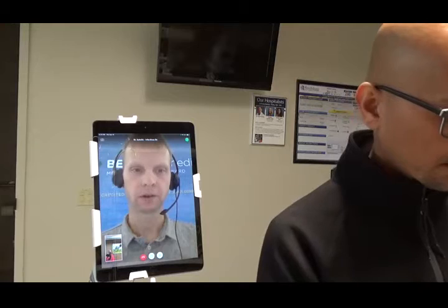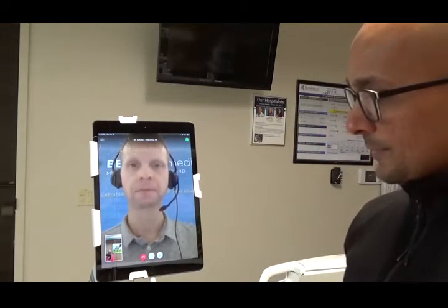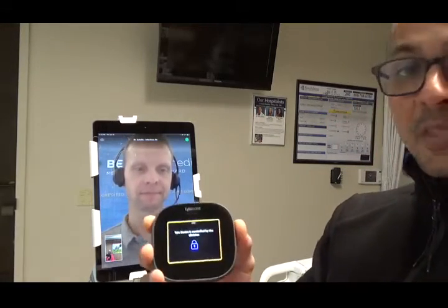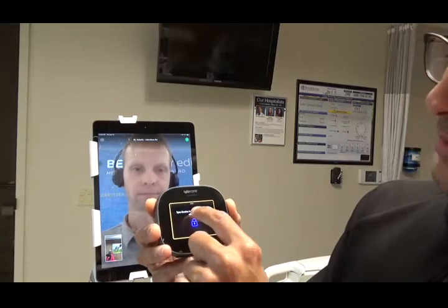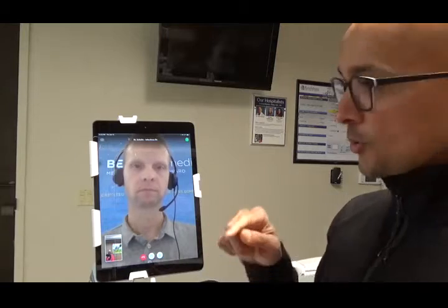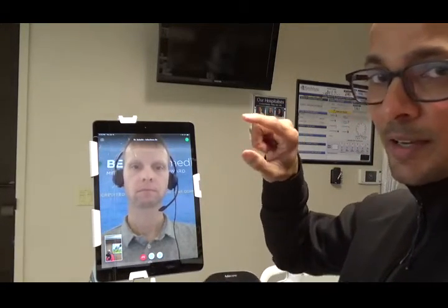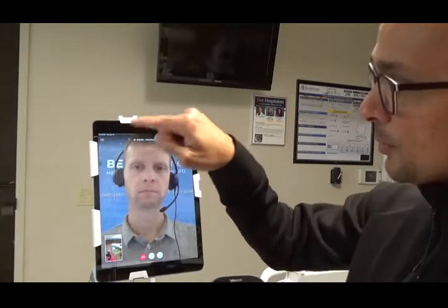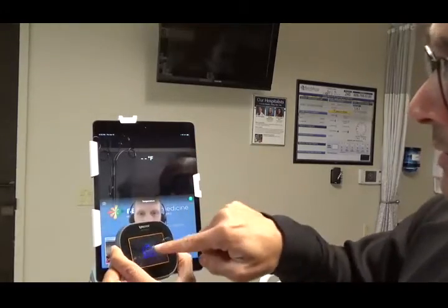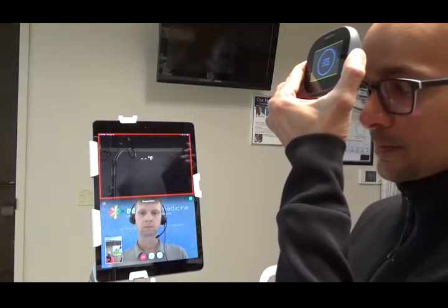Yeah, why don't we start off with a temperature check. I am infectious disease after all. Yeah, so for this device, right now it says the device is controlled by the clinician. So there's nothing that you necessarily have to do. Everything that we want to be done, Dr. Schultz will click on his side, and then it will show up here. So now it says Fahrenheit, put it up here, and then you may have to go ahead and click start on your side maybe.